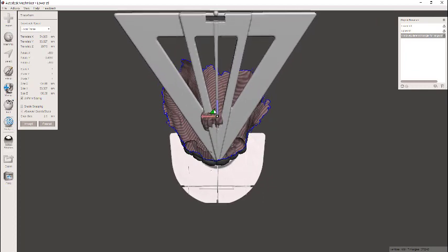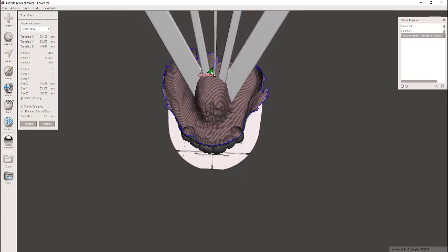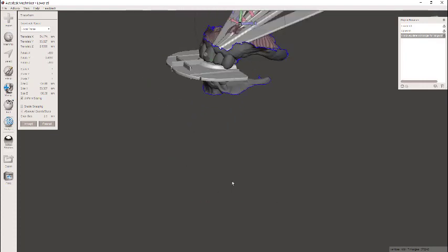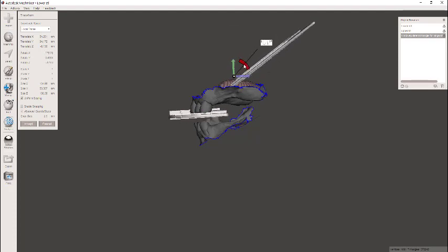And remember too that we're trying to put one of two things, either put the anterior maxillary teeth right up against that vertical component right there. That would be similar to how the Panadent face bow and articulator works. If we were going with the true Bonwill triangle, we would be trying to align the end of this triangle to the lower incisor, somewhere in about that region. I'm just going to split the difference. I'm going to go right in between the two. Okay, so occlusal plane looks like it's about like so.